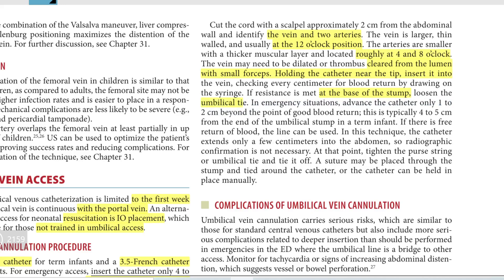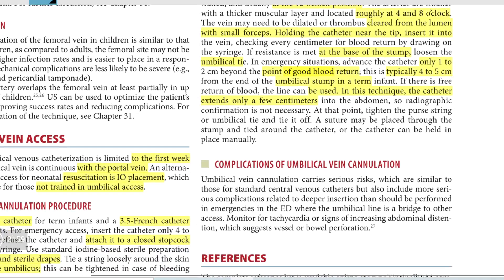In emergency situations, advance the catheter only one to two centimeters beyond the point of good blood return. This is typically four to five centimeters from the end of the umbilical stump in a term infant. If there is free return of blood, the line can be used. In this technique the catheter extends only a few centimeters into the abdomen, so radiographic confirmation is not necessary.